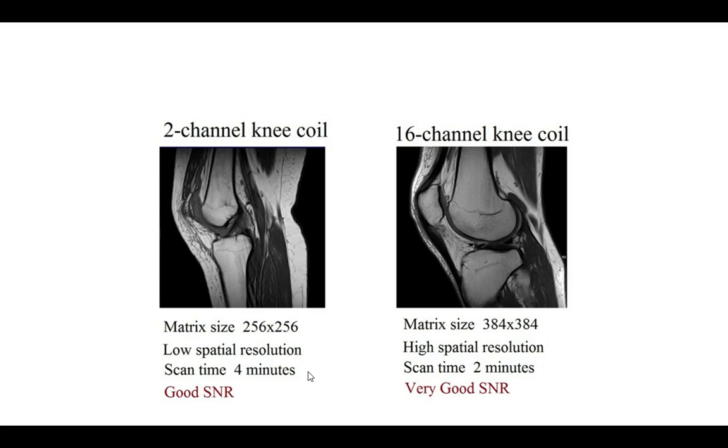So this is with the arrays I was mentioning. It's probably a little bit hard to tell because of limits to projectors, but this is essentially a look at an image with a 2-channel versus a 16-channel. You can see the resolution is just much better, and it is faster. All of these things have improved because I just gave you a better readout machine. I gave you 8 times as many channels, so you just have more coils to do a readout.